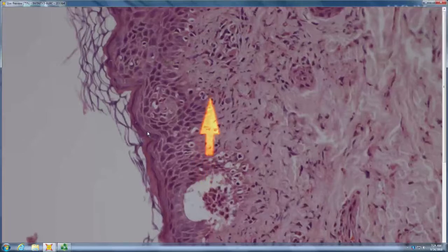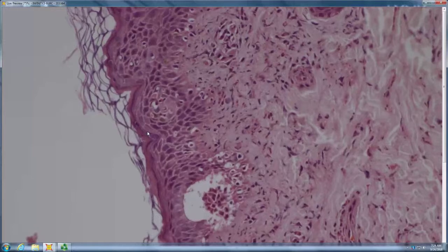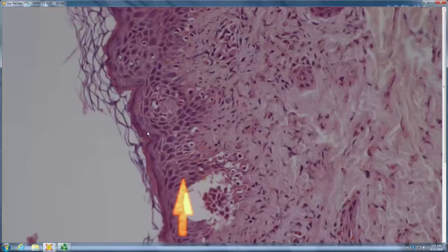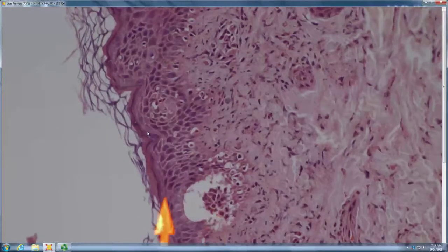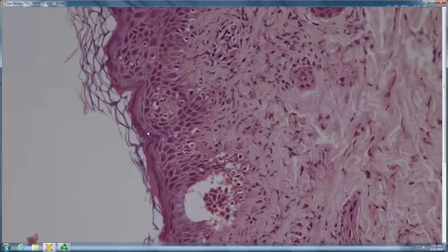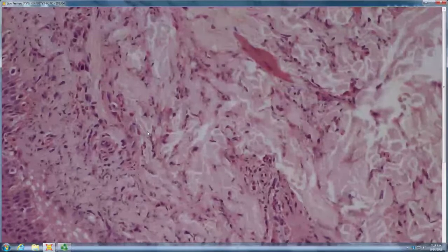There are some individual neutrophils lined up along the DE junction. This one turned out to be chronic bullous disease of childhood. And what I suspect is the linear array of neutrophils is the immunobullous disease. It's incredibly pruritic, and there was probably some excoriation adjacent to this field, which is the necrosis and the neutrophils. When you have mixed patterns like this histologically, then the IF becomes particularly helpful. Great.